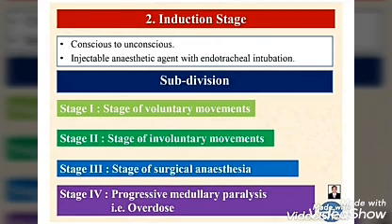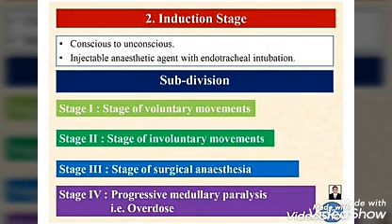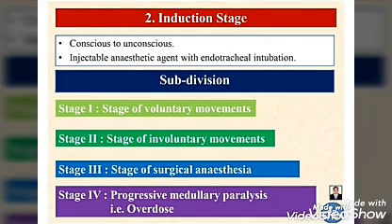Second, after the desired depth of anesthesia is achieved, you perform endotracheal intubation to ease the passage of oxygen, even if the animal is connected to the inhalation anesthetic machine. That means the passage of oxygen along with the inhalation anesthetic drugs. Endotracheal intubation is generally performed for the safety of the patient.